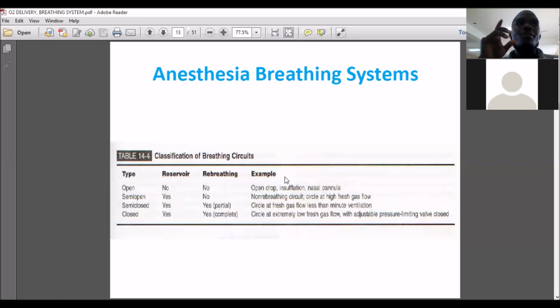But the thing is, of course, it's not your air. I give you the oxygen at first. The oxygen I give you is the oxygen you finish with. I give you at the start, then I close the oxygen tank. You're getting me?